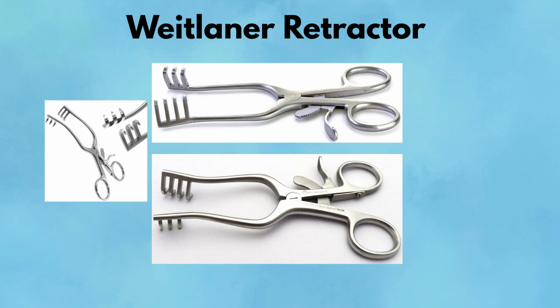Weitlaner Retractor. The Weitlaner is a self-retaining retractor with outward curving prongs and a ratcheting mechanism. It's a favorite for hernia repairs, breast surgery, and anywhere you need consistent exposure without tying up an assistant. Available in blunt or sharp tip versions, it works best when tissues can tolerate mild tension. Pearl: A steady, reliable option that holds the field open for long cases. Pitfall: Don't overstretch — excessive pressure can cause nerve damage or tearing.